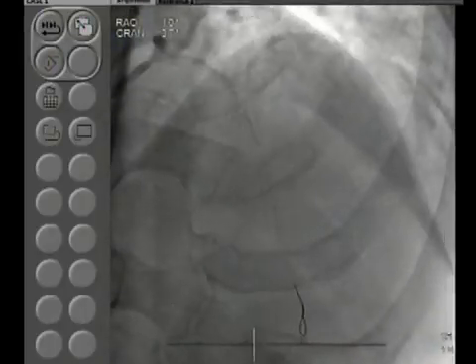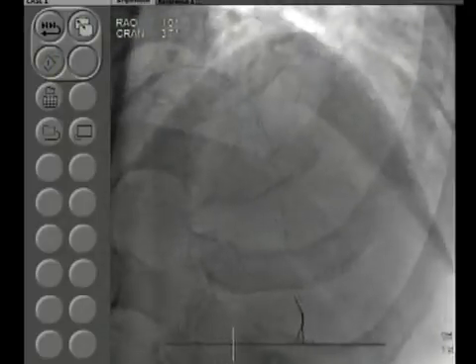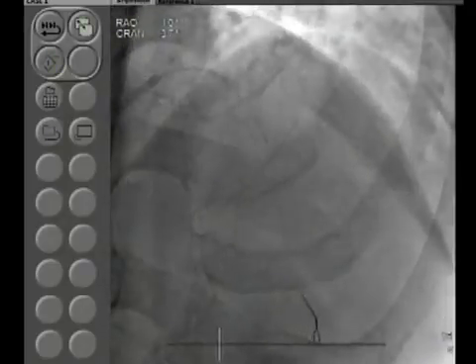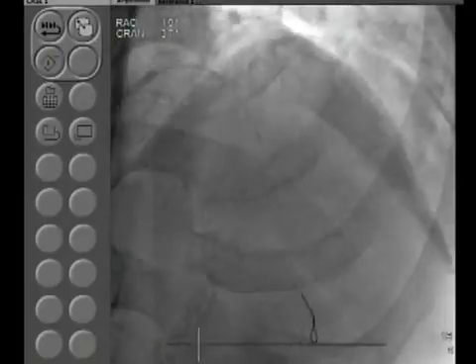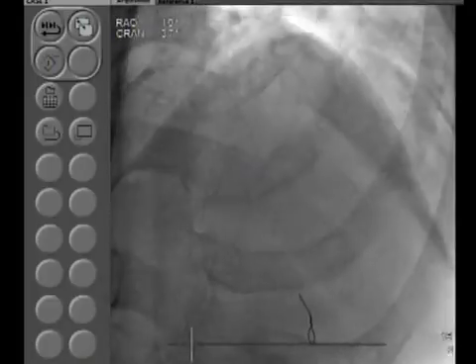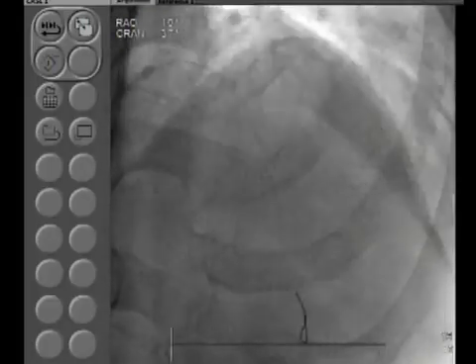You see how we did it. We dilate, we take the balloon, we leave it in the guide, and we take a quick cine. In the rare cases of a perforation, you have your balloon there, so immediately you can go in and use the balloon to tamponade the vessel immediately. Good.